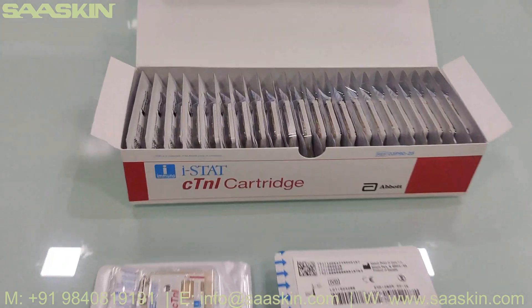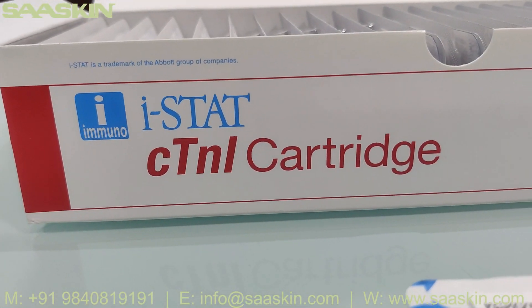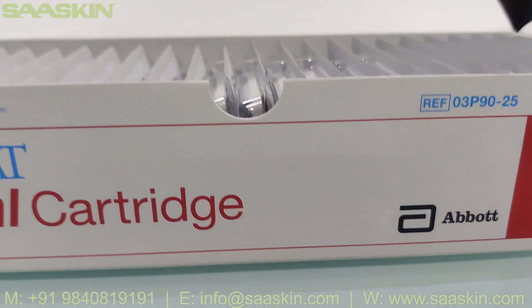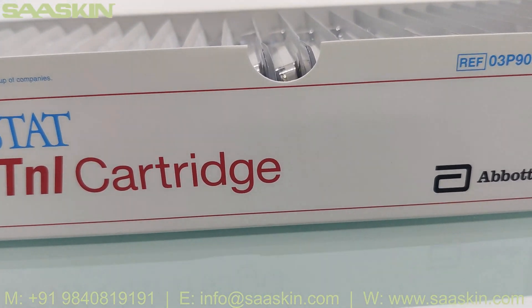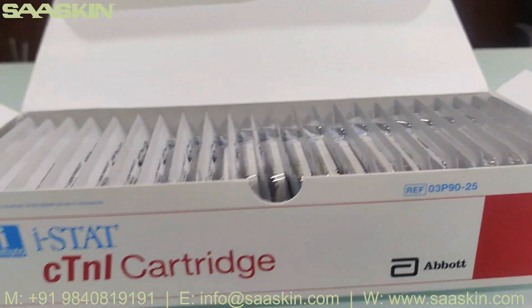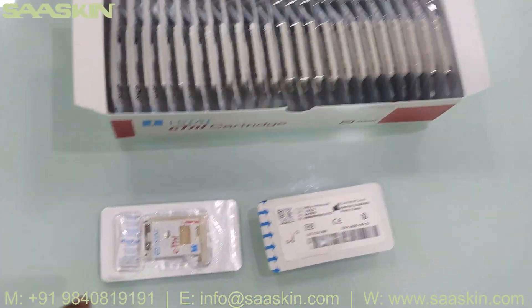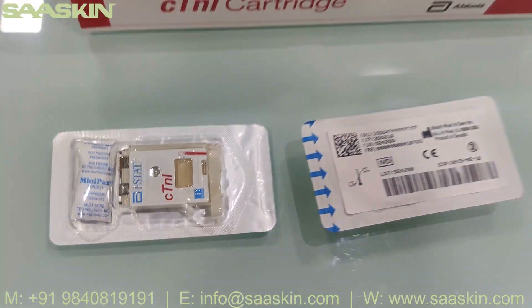To summarize: today we saw the unboxing of the i-STAT cTnI Cartridge, which is primarily used for measurement of troponin I level. That's the part number, and this is the 25 test kit pack. You can see the 25 test kit pack, and this is how the individual cartridges looked like.